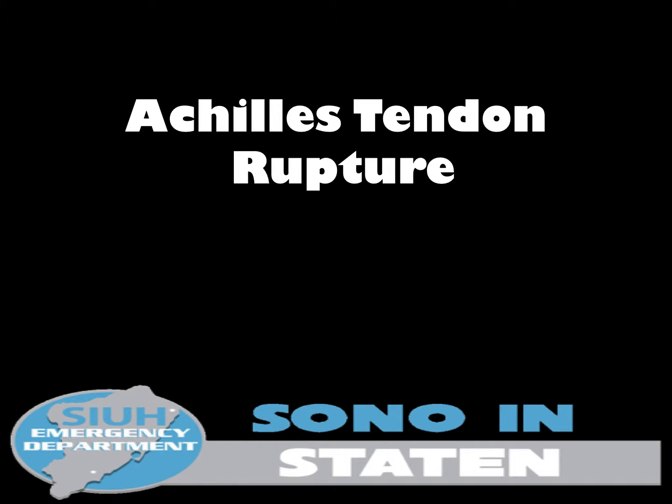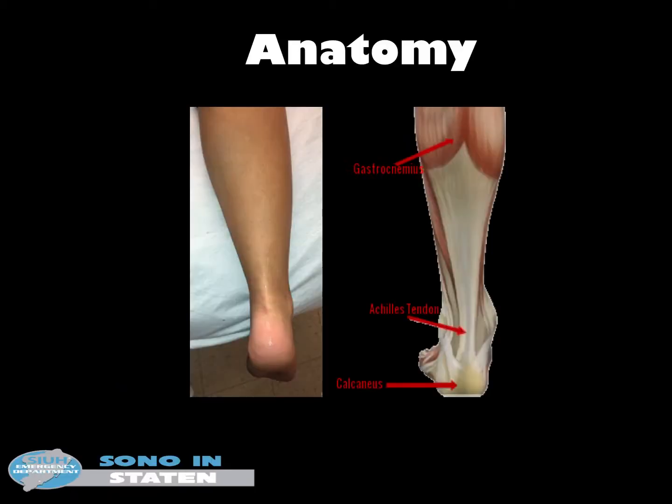Today we'll be talking about how to use ultrasound to diagnose Achilles tendon ruptures. Achilles tendon ruptures occur due to overuse from repetitive activities such as running and jumping. The Achilles tendon connects the gastroc and soleus to the calcaneus. Ruptures typically occur 2 to 6 centimeters proximal to the calcaneal insertion.